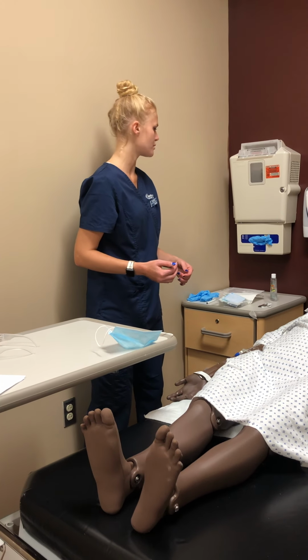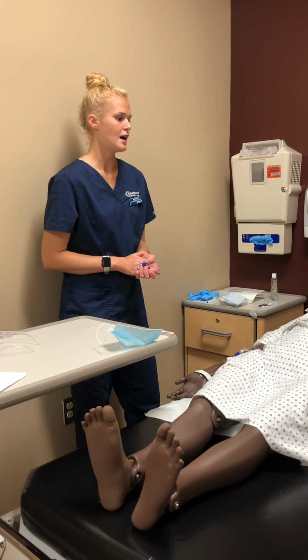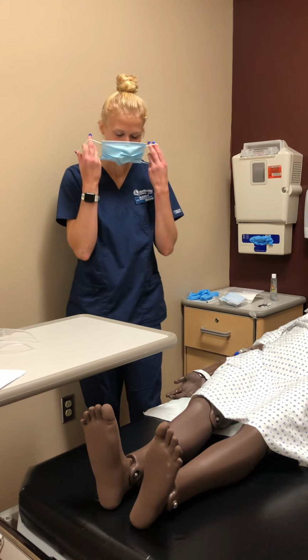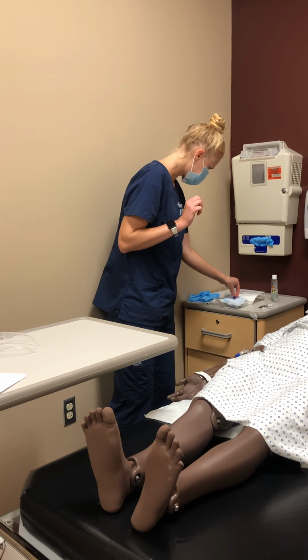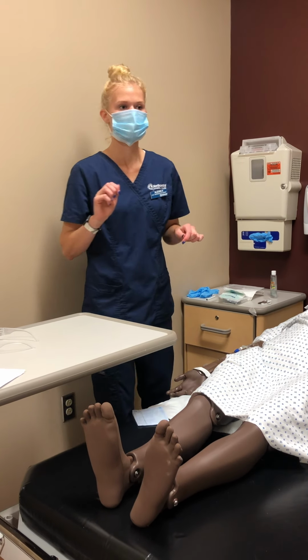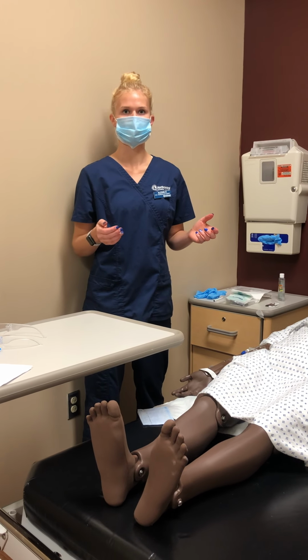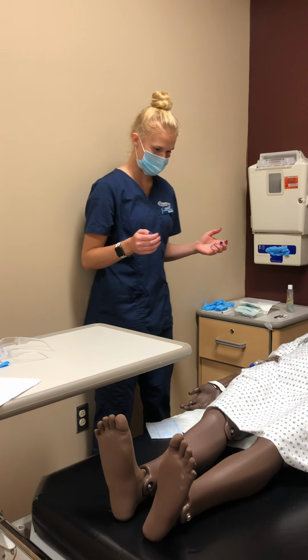So I'm going to wash my hands, and then put on a mask for me, and then wash my hands, and then go ahead and put a mask on my patient. If my patient did not want a mask on, I would tell them to look away during the procedure that I'm going to be doing today.